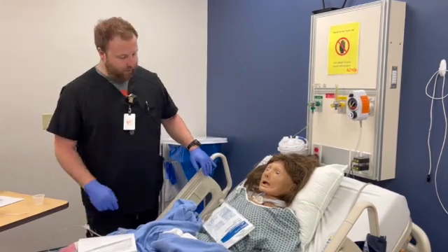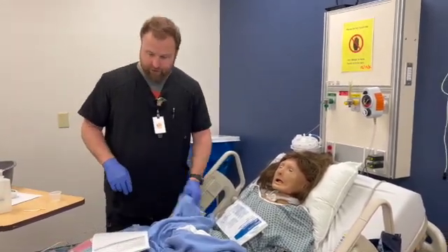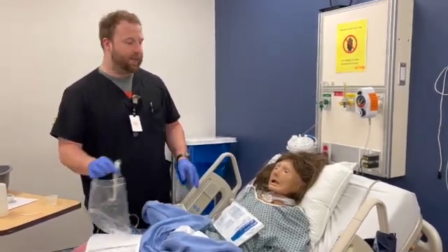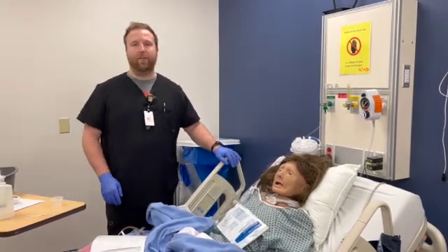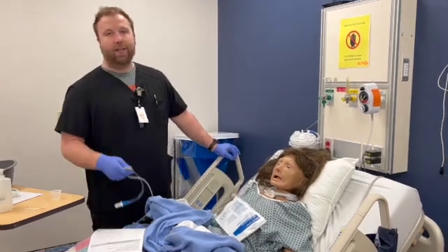I'm going to offer some oral care. There's a toothbrush here somewhere. We'd offer some oral care and provide any other comfort needs. And then I would document how the patient tolerated the procedure and document any drainage I had in my suction bin. And that will be all.